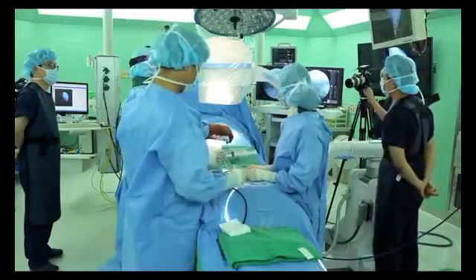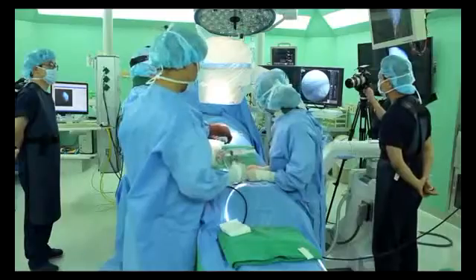The catheter trajectories are decided by each patient's different caudal canal and spinal canal structures, and by the three-dimensional structure of the lumbosacral angle and thecal sac. The ending point and shape of the thecal sac have an impact on the trajectory. You can reach the target point and check it with the C-arm.